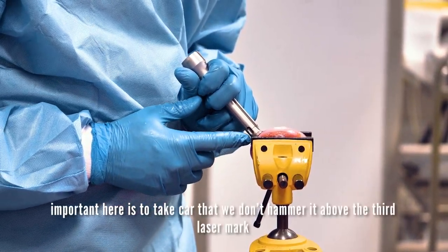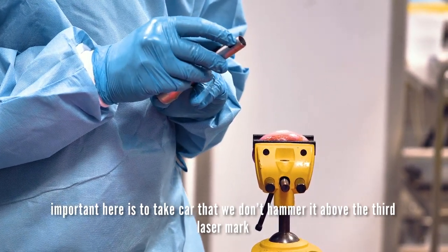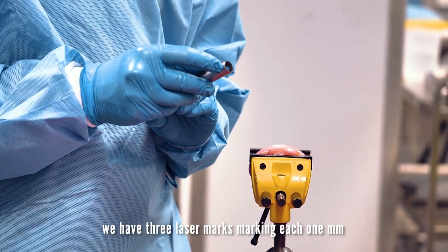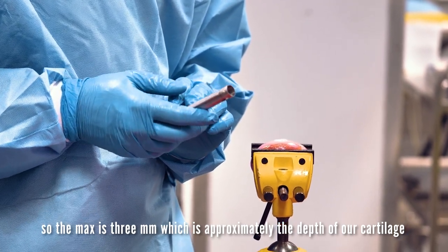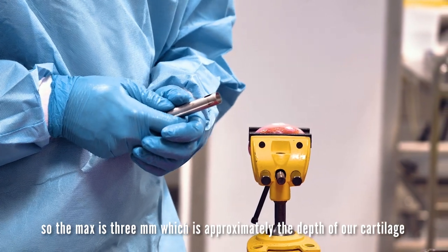Important here is to take care that we don't hammer it above the third laser mark. We have three laser marks, each marking one millimeter, so the maximum is three millimeters, which is approximately the depth of our cartilage.